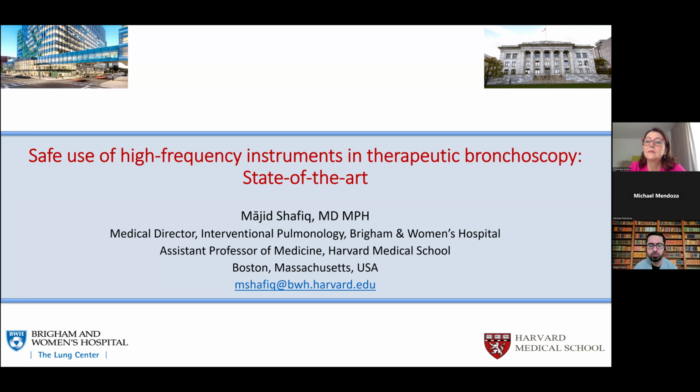I think what probably happens when you increase APC duration or any of those things that I showed in that schematic with the bars is that you change what is the depth of, let's say, vaporization, or what is the depth of tissue that is getting heated up to the maximum degree, without necessarily increasing the overall depth of effect of APC. And because you're not really increasing the overall depth of effect, and that depth of overall effect, even minimal, is so superficial, typically no more than 3 to 5 millimeters, my feeling is that airway perforation is exceedingly unlikely with APC. However, I would worry about that too.